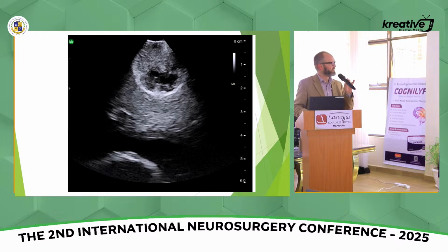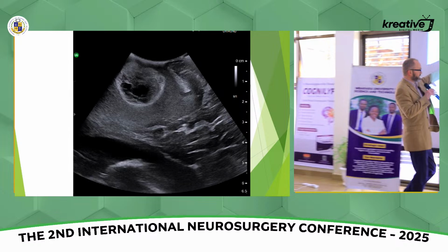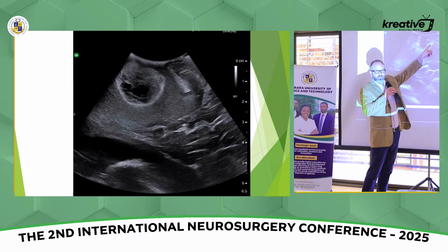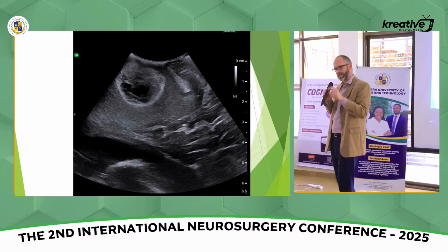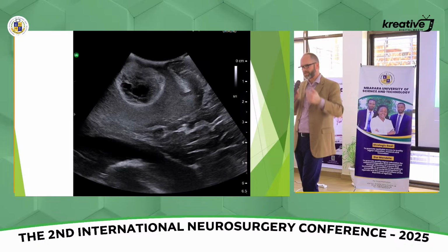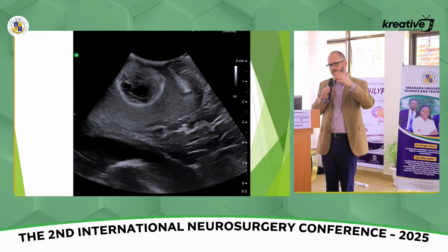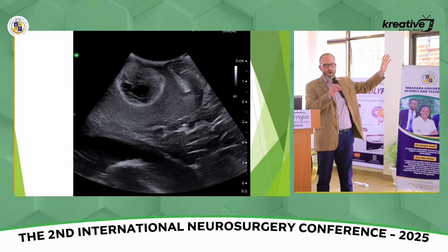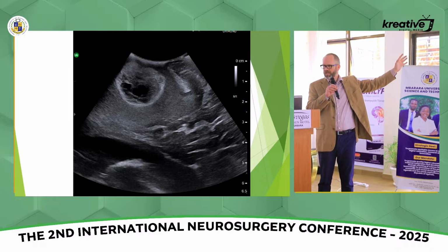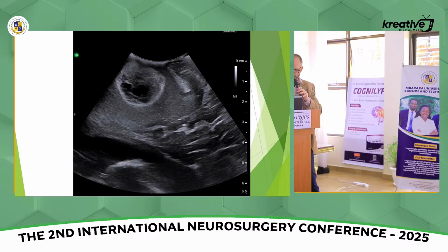This is another picture of that same patient, now after resection. We have a little bit of cytotoxic edema around the margin of resection. How you know that that's not tumor is because you've either taken pictures of the screen to then refer back to, so you freeze and save those images so you can look back and remind yourself, and you've looked multiple times with the ultrasound over the course of the procedure, so you'll watch that part of the brain change over time, so you know it's cytotoxic edema and not residual tumor.